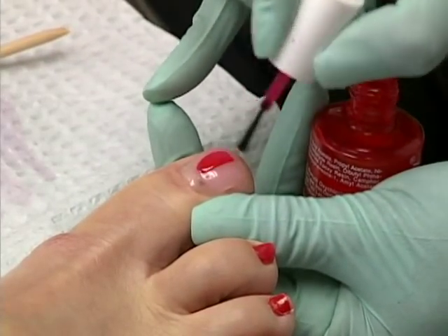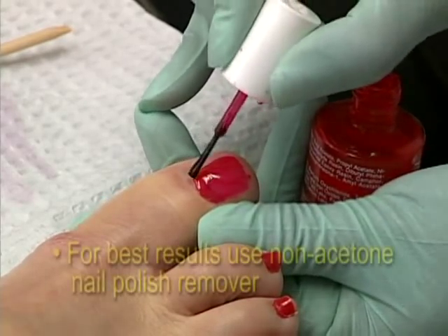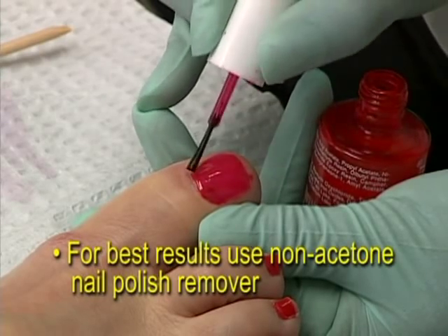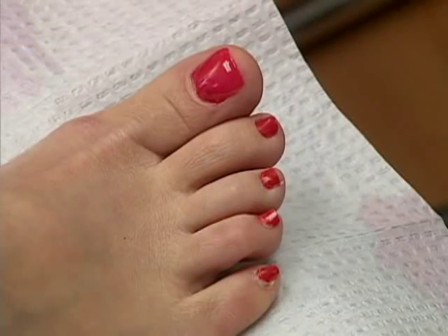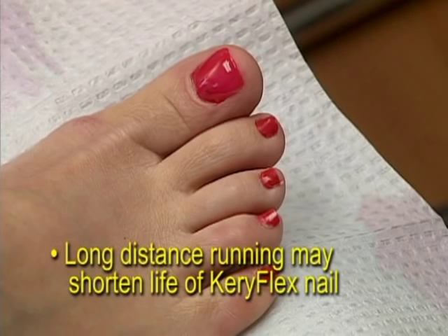Patients may also apply nail polish immediately to the new Keriflex nail. For best results, the patient should use non-acetone nail polish remover. The Keriflex nail requires very little care. Patients should avoid kicking objects, which would subject the Keriflex nail to mechanical stress. Long distance running may shorten the life of the Keriflex nail.